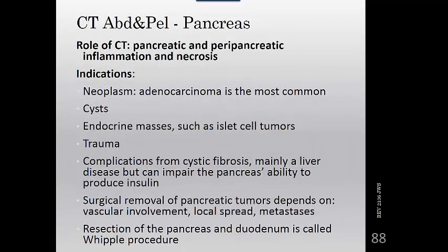Okay, let's talk about the pancreas now. CT imaging is the method of choice for evaluating the pancreas for most indications, and it provides more reliable overall data than ultrasound and plain films, and contrast enhancement of the GI tract as well. So a technique that includes the use of thin slices and IV contrast improves the likelihood of visualizing the main pancreatic duct.